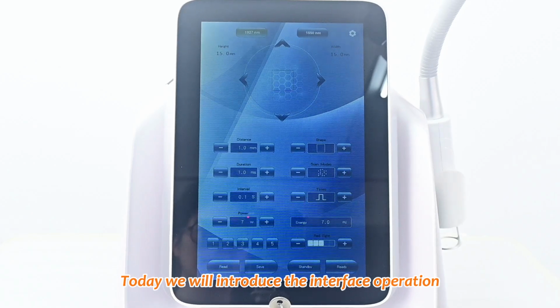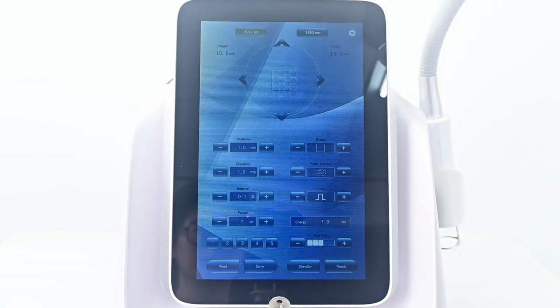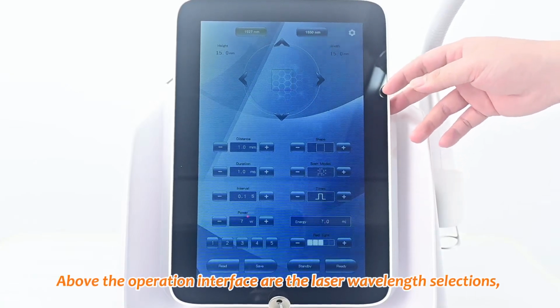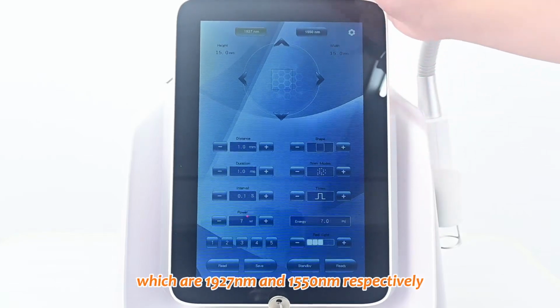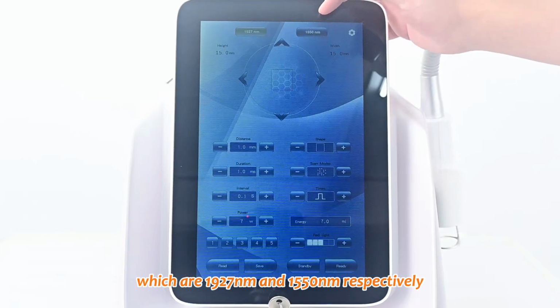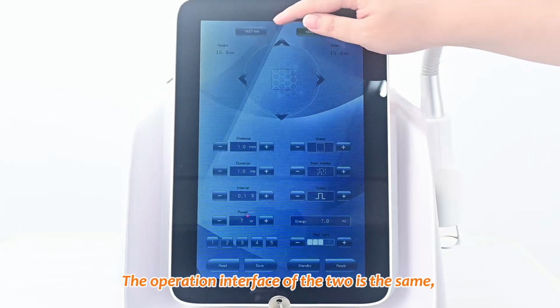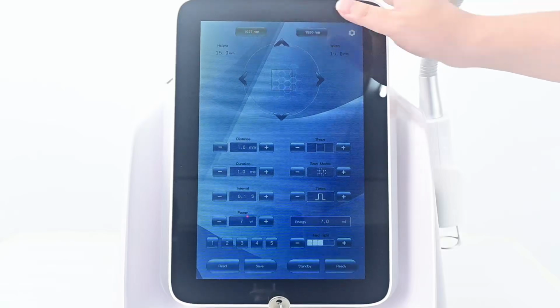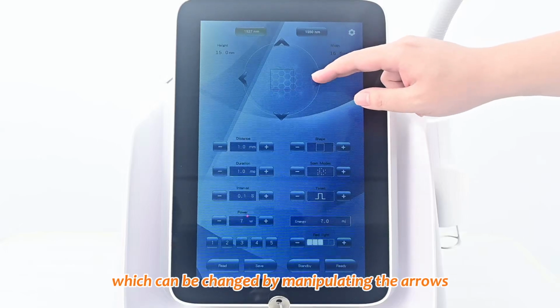Today we will introduce the interface operation and practical operation of the 1927 nm laser. Above the operation interface are the laser wavelength selections, which are 1927 nanometers and 1550 nanometers respectively. The operation interface of the two is the same, but the probe needs to be replaced during operation. Below is the size of the graphic, which can be changed by manipulating the arrows.